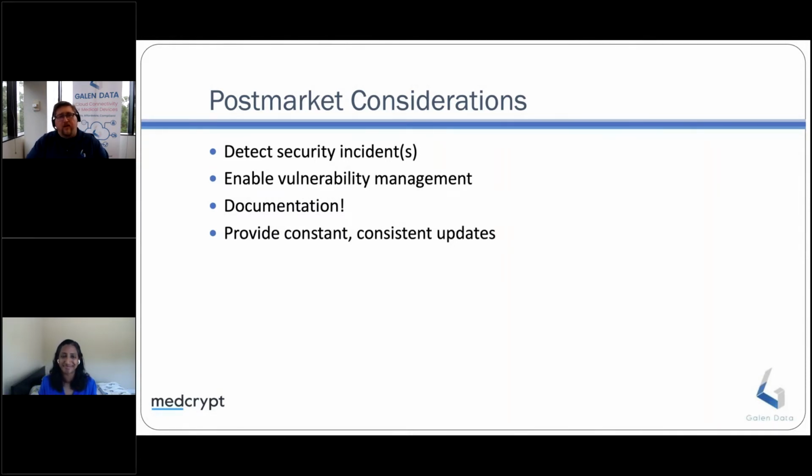And 10 years later, why does this software keep breaking? How did we get hacked? Well, you're running 10-year-old software with all these vulnerabilities. So, constantly updating, consistently doing that rigor, looking at those types of frameworks, seeing what the updates are, incorporating and testing them, it's a lot of work. It really is, but it's worth it because you have the mindset of constantly addressing vulnerabilities as they present themselves.